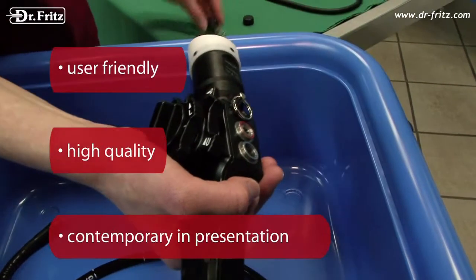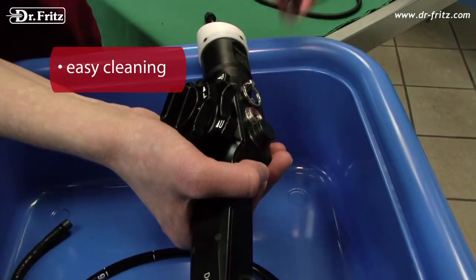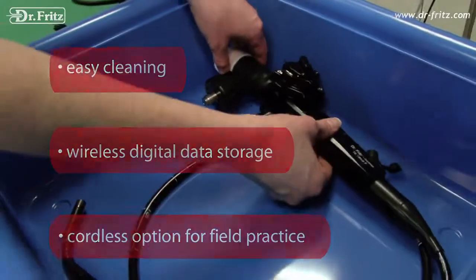High quality. User friendly. Contemporary. Easy cleaning. Wireless digital data storage. Cordless option for field practice.